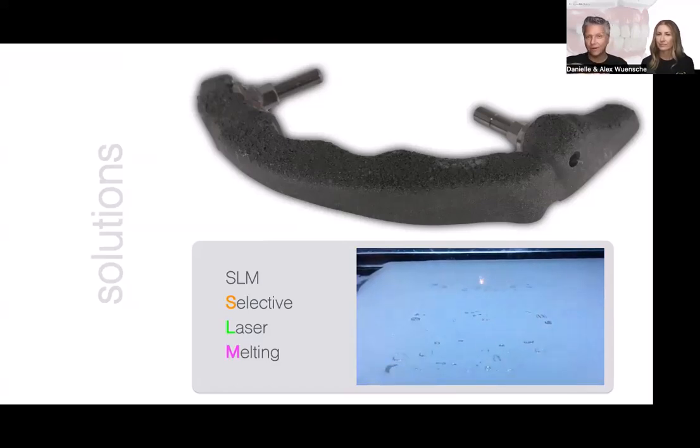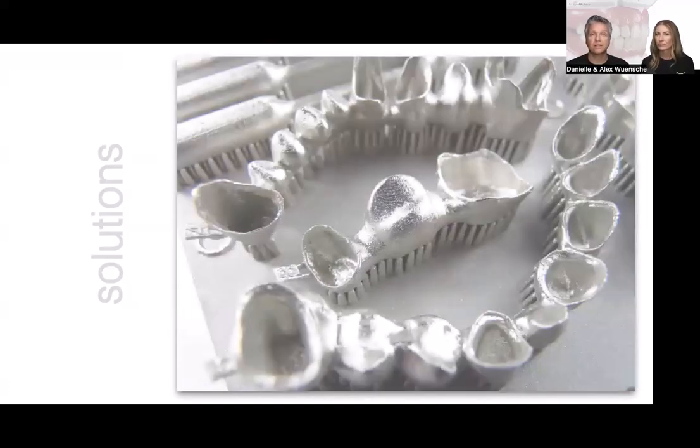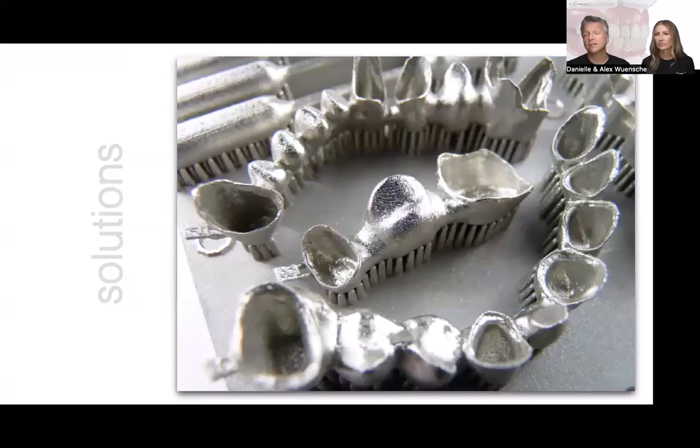And then after the whole plate is melted, the slide goes to the other side, applies another layer of powder, and then the next layer basically gets melted together to a final shape, which looks like this. What we see on this photo here. These are crown bridges, but even the secondary frame looks the same, right? It grows up with that metal plate, and it's a very clean process. It's a very nice fitting process.